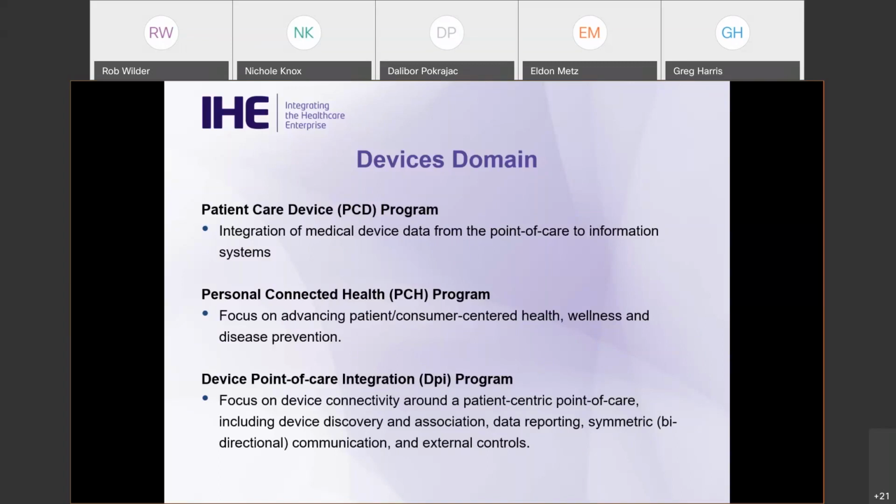So while some of the programs within this domain have been around for years, the devices domain itself was newly formed in 2019. This was driven by a joint effort that's ongoing right now between Personal Connected Health Alliance, or PCHA, as you might have heard of it, and the IHE International to further align our respective goals and our operations. These groups both had similar interests, and it made sense for us to combine forces to improve innovation while simplifying the pathways to interoperability for any interested parties looking to pursue those.